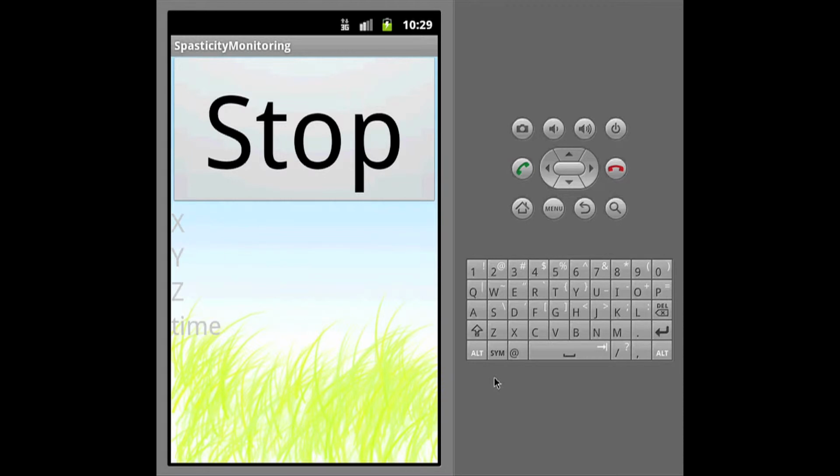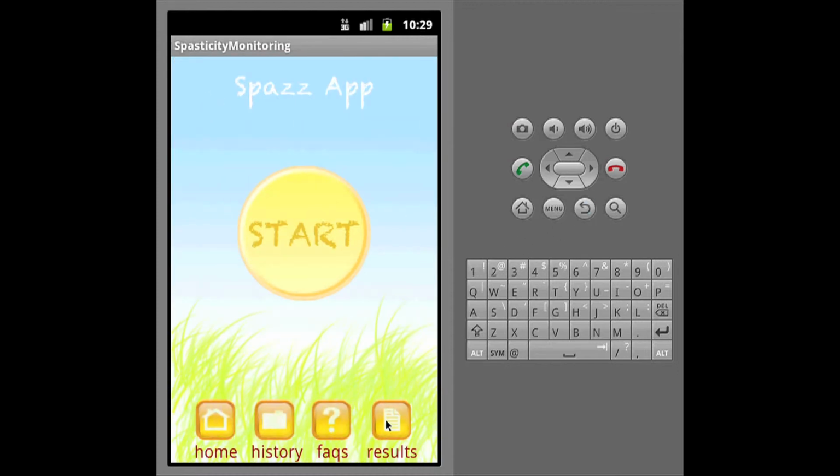So now the accelerometer is actively recording the person's movement, and it will spit out data in the X, Y, and Z axes. And after about 8 seconds, the recording will automatically stop, and it will graph everything that it recorded. We can't show you here right now because of some limitations. It'll show an error, but generally it's going to look like this. It's going to have a graph with a bunch of data running all across.